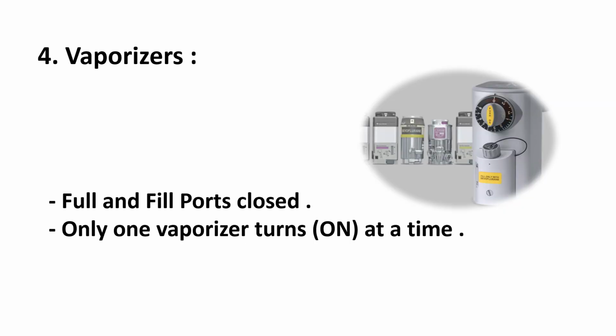Number 4 is the vaporizers. I should make sure that the fill ports are closed and only one vaporizer is working at a time, not both of them, to avoid a mixture of different agents and their side effects.